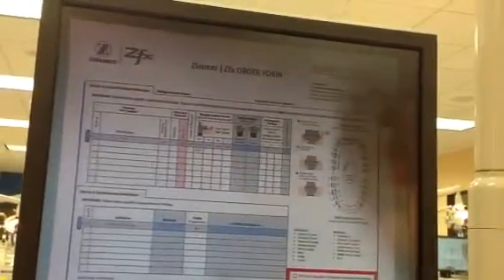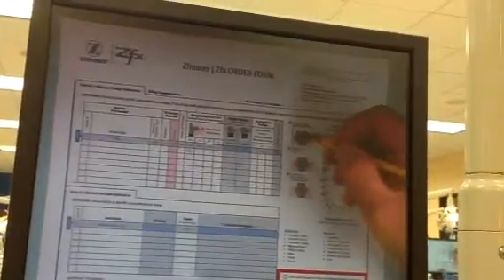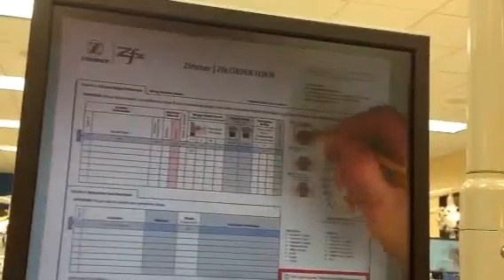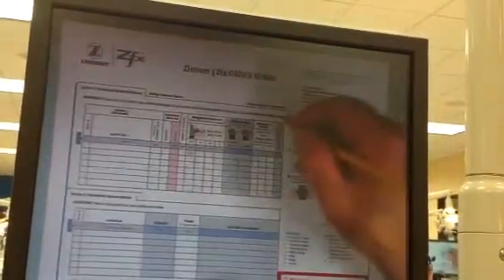Now, on occasion, I'll have a crown made, and then I'll decide that, you know what, I'm going to screw retain my cement retained crown. I will cement it with a permanent cement, I will drill a hole in it, and then I'll screw it in place. But at any rate, I like these patient-specific abutments.